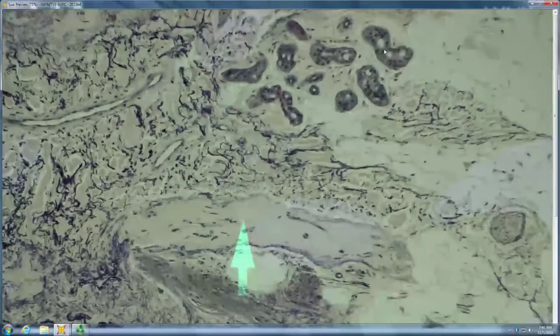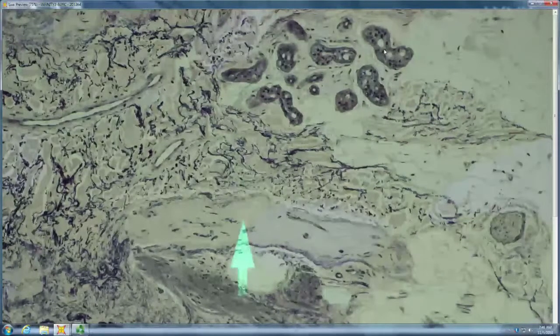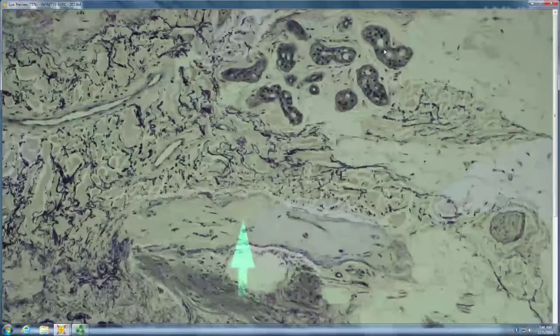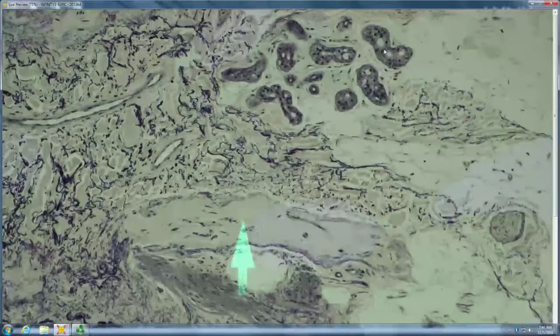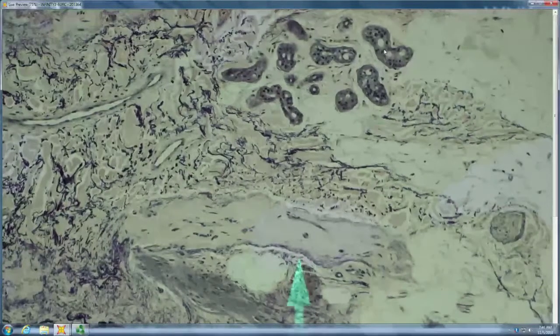That's what a fibrous tract remnant is, or you'll hear the term stela, S-T-E-L-E, stela, or some people pronounce it steel. It was the column of stones that the Roman legions erected to a fallen soldier. So these are supposed to be the little monuments of the fallen hairs, right? So that's where that term comes from. But the foot is no longer in the sock, but the sock remains, is basically the idea. But that's what a totally normal fibrous tract remnant looks like.